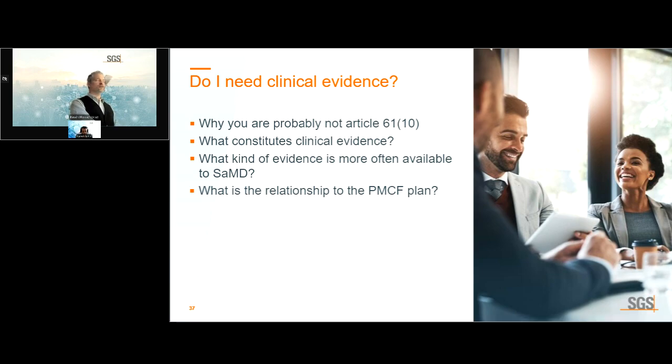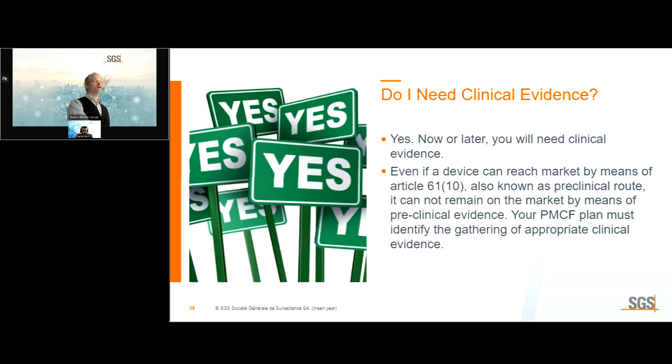What kind of evidence do you have for SaMD, which actually there's a special kind that only software usually has access to, and how does it relate to your PMCF plan? So, do you need clinical evidence? The answer is yes, one way or another. Now or later, you need one.